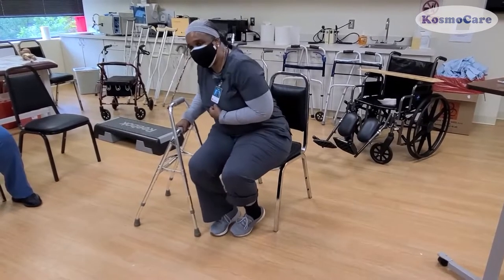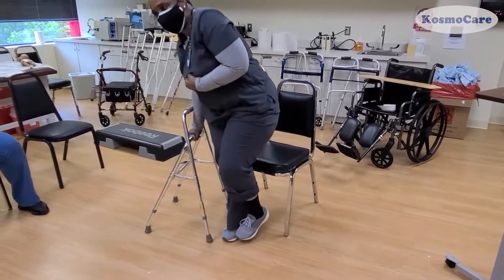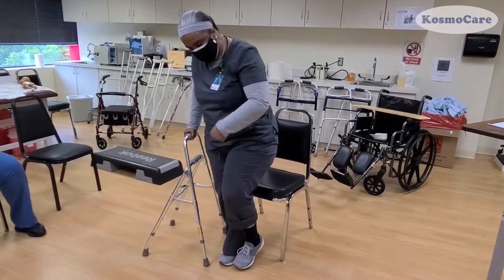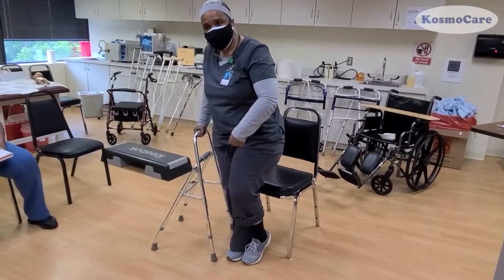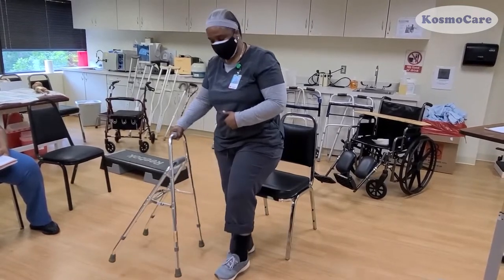The lower part of the handle is used to stand up from the sitting position by the non-affected side of the user. The Hemi Walker is used by advancing the user's affected leg and the Walker together, and then leaning on and moving the stronger side forward, as demonstrated in the video.